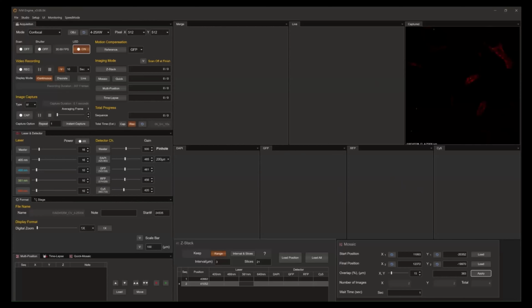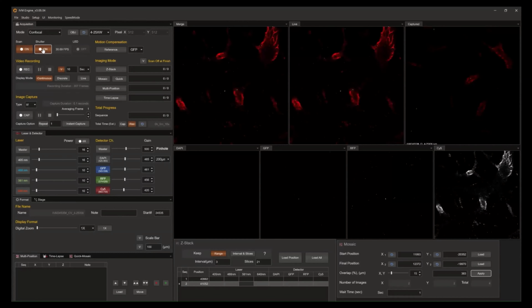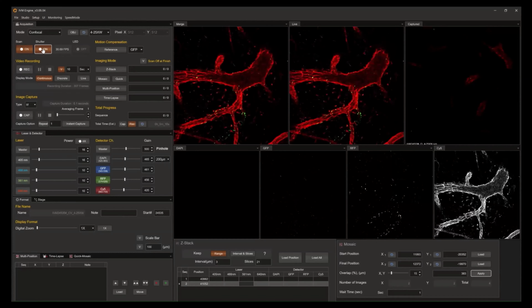To ensure the optimal excitation and detection during in vivo imaging, I've already adjusted the laser power and detector values. By activating the scanner and shutter, we can locate the focal plane until the signals are displayed, enabling us to observe the morphology of the lymph node blood vessels. Using the jog dial, we can navigate to find the best field of view on the cover glass.